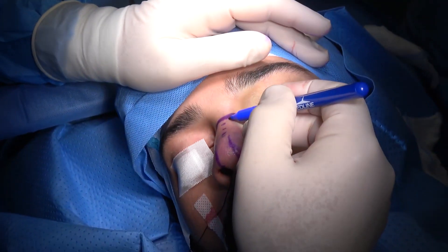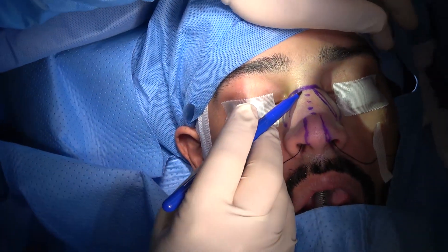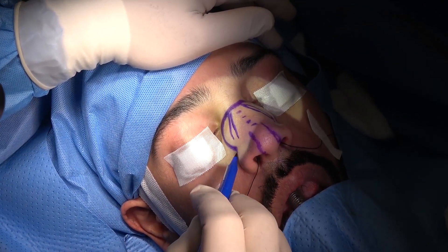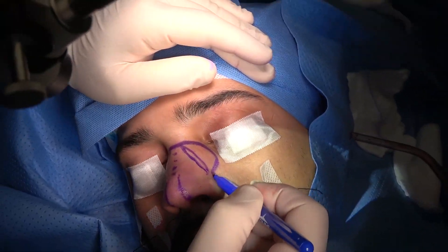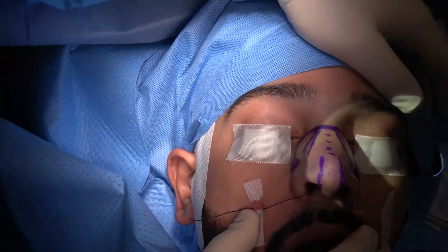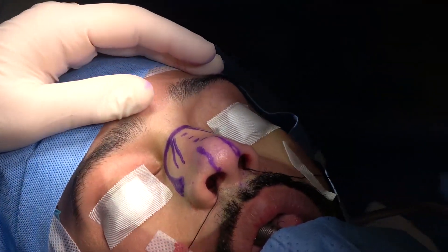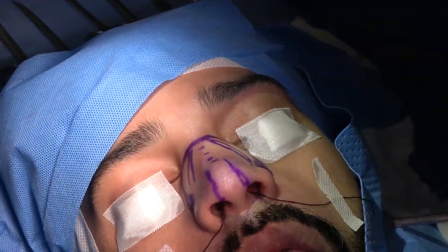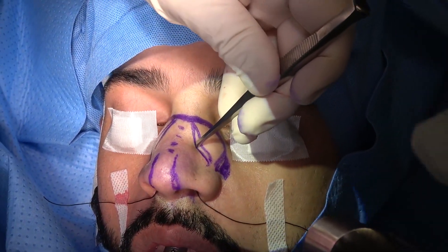We are going to consider double mid-lateral and lateral osteotomy, and will preserve this small piece of bone there. So let us start our lateral osteotomy now, from the left side first — the upper mid-lateral first, as you see.